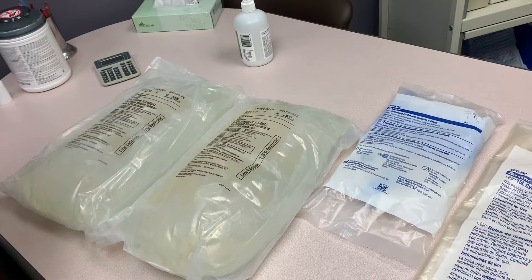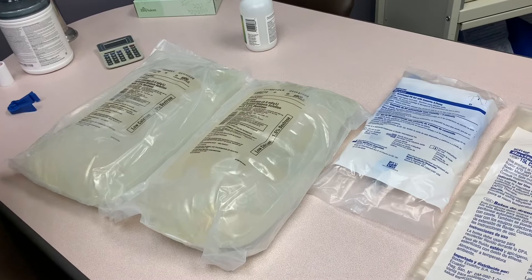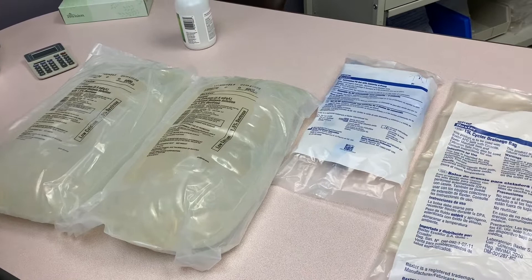This is a quick demonstration on setting up the cycler for a peritoneal dialysis patient. You will have the doctor's order in Epic, and normally you will need two six-liter bags of solution.